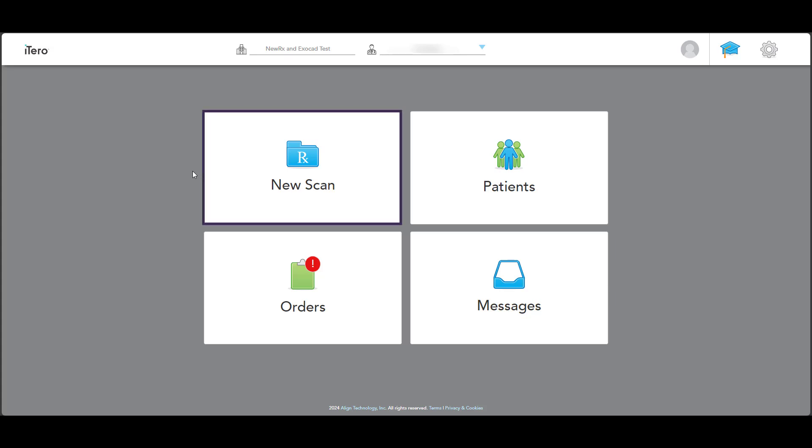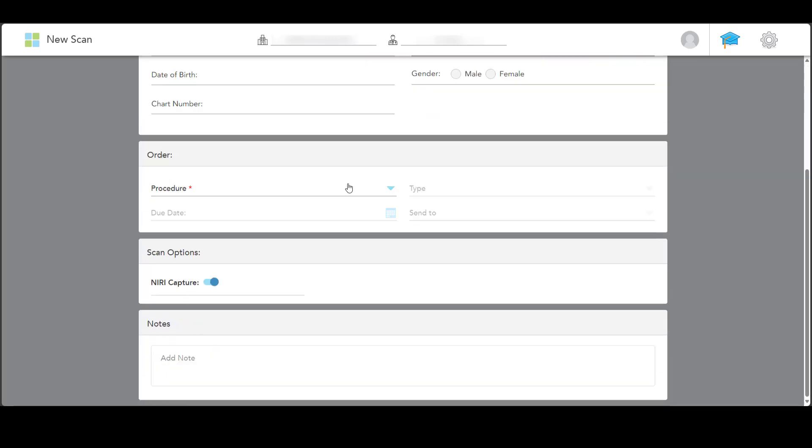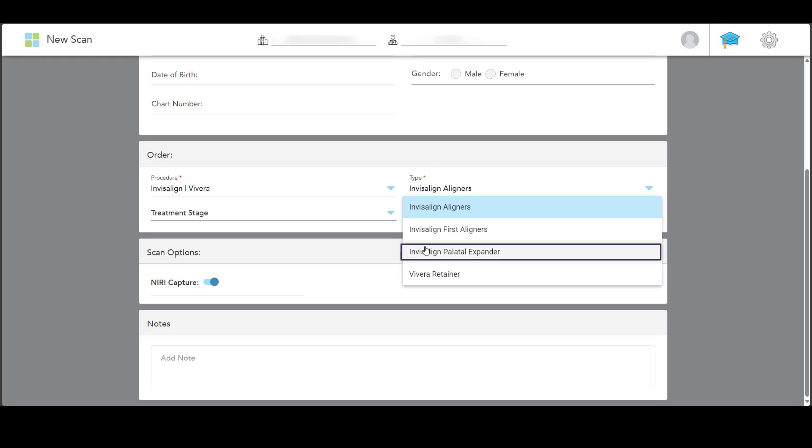Start by clicking the new scan button. Fill in the Rx and select the Invisalign Vi-Vera procedure, then pick the procedure type Invisalign Palatal Expander.